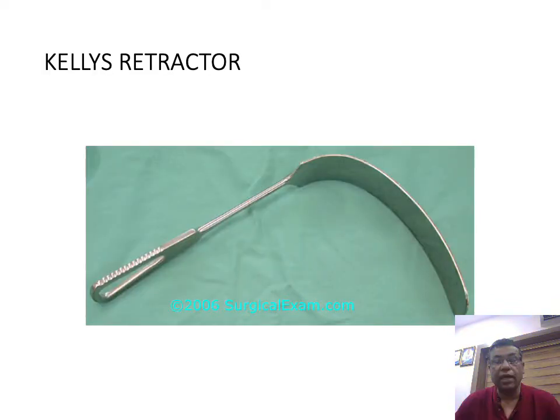This is a Kelly's retractor. Kelly's retractor has the advantage that it can retract solid organs as well as hollow viscera. It is used for deep abdominal retraction, mainly for surgeries like cholecystectomy and also for splenic and pancreatic surgeries. We commonly use it when we don't want deeper injuries.